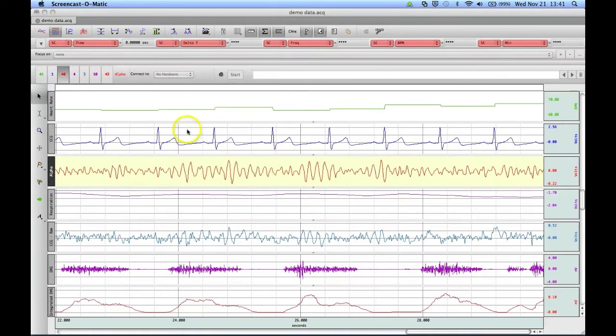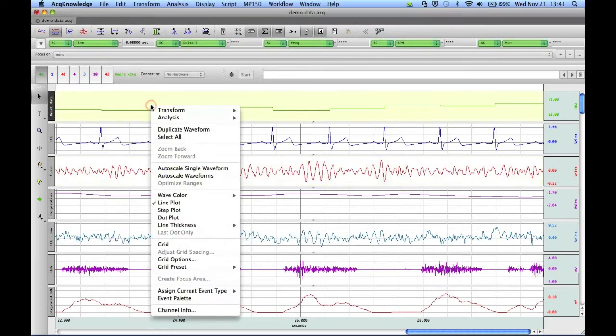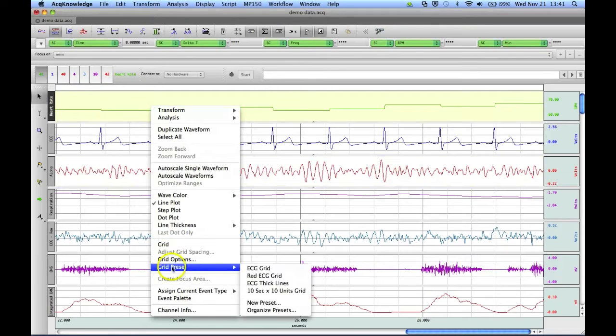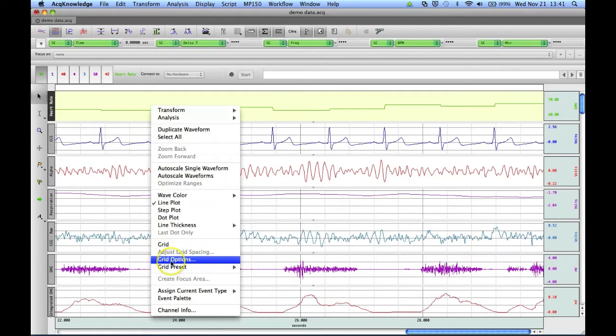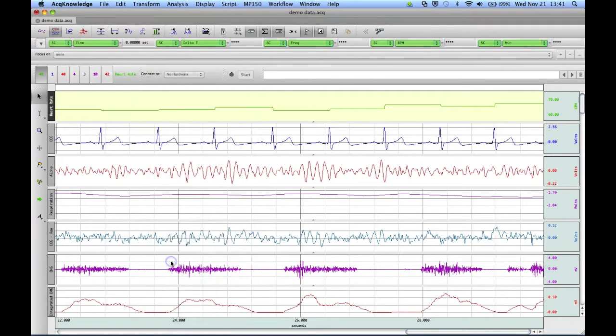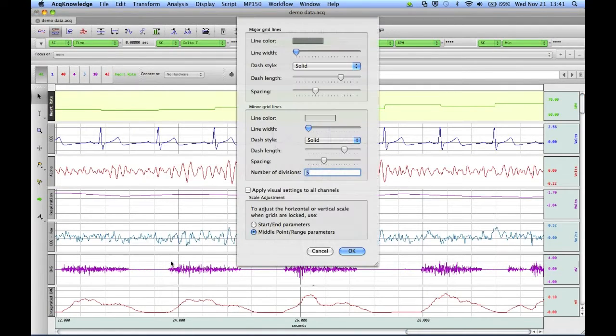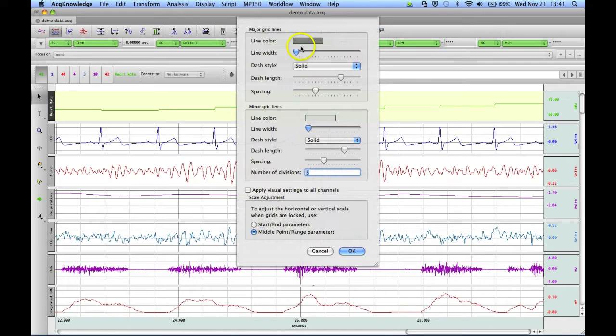Let's first create a customized grid for our heart rate channel. To do this, we can right-click, select Grid Options, and here we can choose the line color, width, and style for our grid.